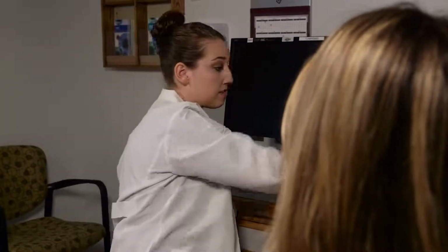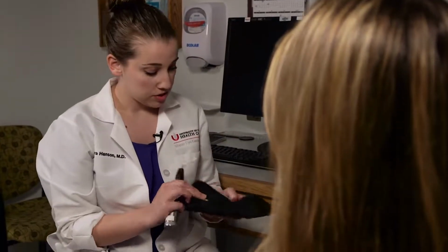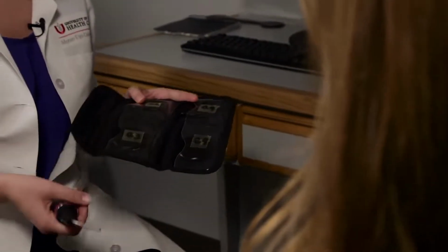Okay, so now we're going to be testing for an afferent pupillary defect, and we'll talk about how to measure the size of the defect. All you need is a muscle light and some neutral density filters. The ones that we have here are in 0.3 log unit increments, and we have a 0.3, 0.6, and 0.9.